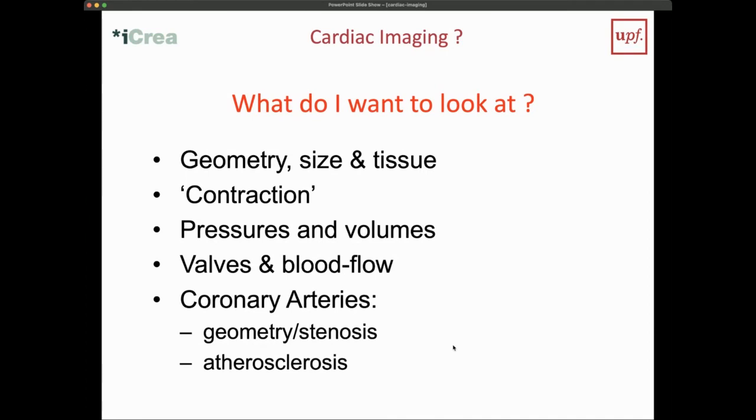And from what I've been saying about the imaging modalities, I think it's clear by now that not one modality can provide all this information at the same time and with the same temporal and spatial resolution. So we really have to see which of the modalities we are using, and when we will need to use another imaging modality in order to provide some specific answers for a certain patient.